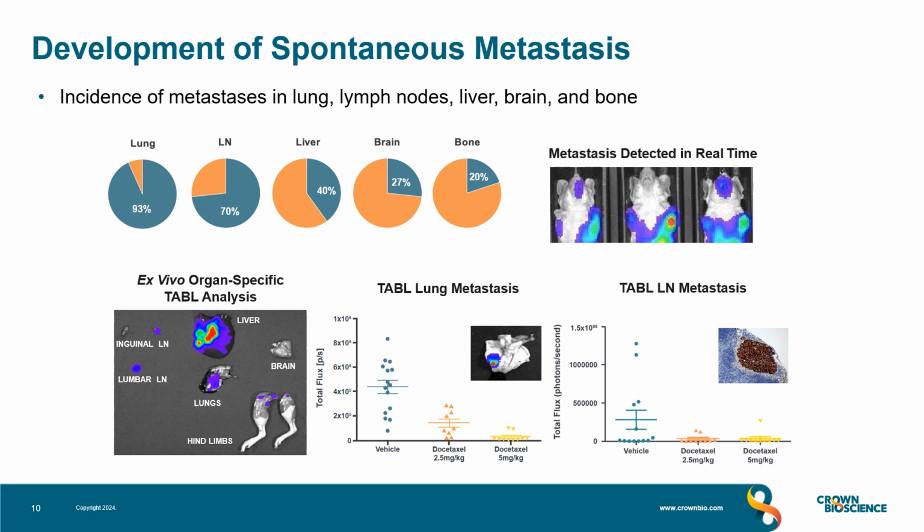This model can also be used to measure the development of spontaneous metastasis. So this can be done with two main approaches. You can do some metastatic measurements in the live mouse, and there's some data shown in the top right hand of the slide. And we can also do metastatic measurement ex vivo.